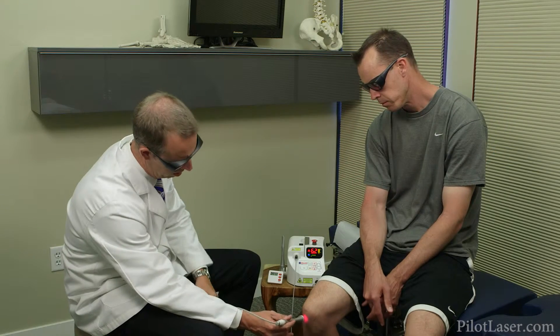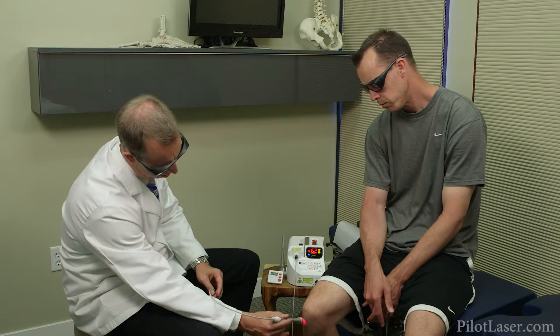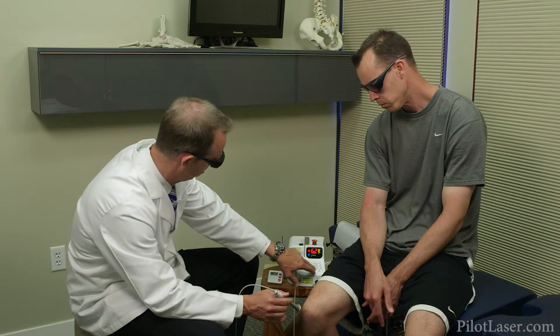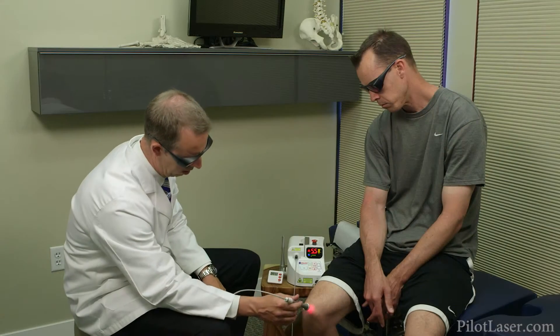There are a few factors that will require you to change the level of wattage and the amount of time you apply the laser to the treatment area. For example, with darker skin pigments, tattoos, hair, or moles, you'll need to lower the wattage, use the larger handpiece, or even hold the laser a little above the skin like this.